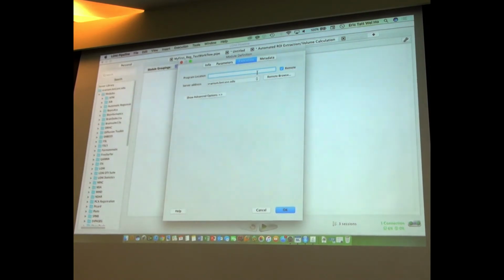Let's see. What kind of commands do we have on a Mac? Because I want to run one thing locally. Obviously, I can go on the system and type something like bin cat, okay?